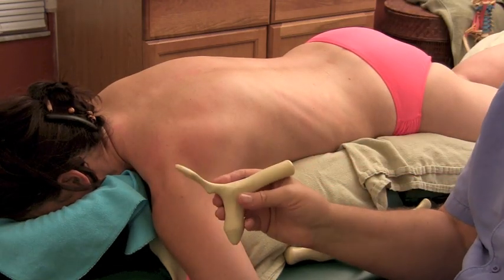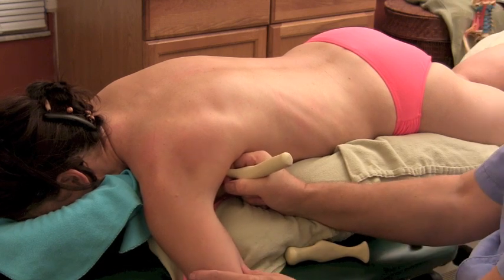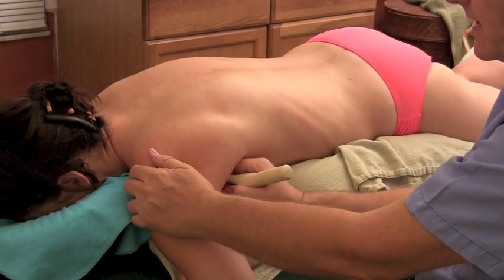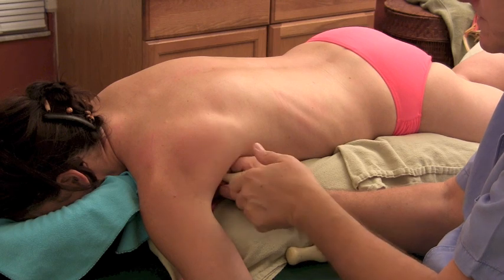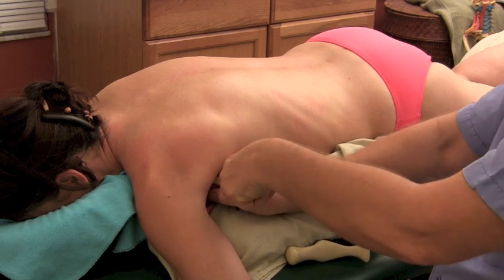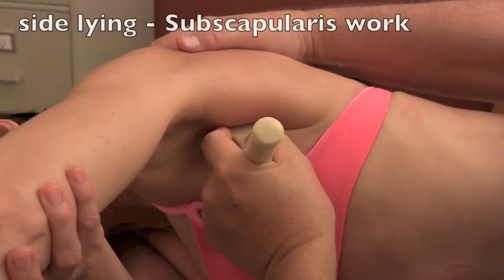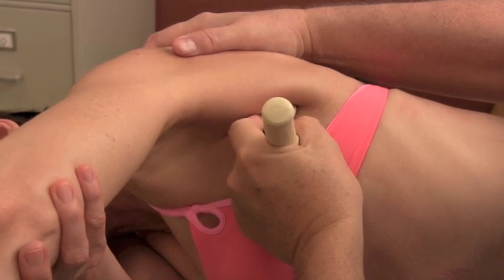That's where the spoonbill tool comes in — it is just a dream come true. You can slide up underneath there just like that. You can vary it; you can see her scapula nicely here, that's why I chose her for this demonstration. I can slide that right up underneath there, and my intention is to push up into there and also put pressure laterally and superior. On some people I could even put my hand — that's why I made this handle longer — so I can use this as a fulcrum to put extra pressure into the underside of the shoulder blade. If somebody's very sore, you may just sneak in there and stop and hold. Oh, there we found a sore spot — we're actually getting into something in this position that we couldn't get the other way.